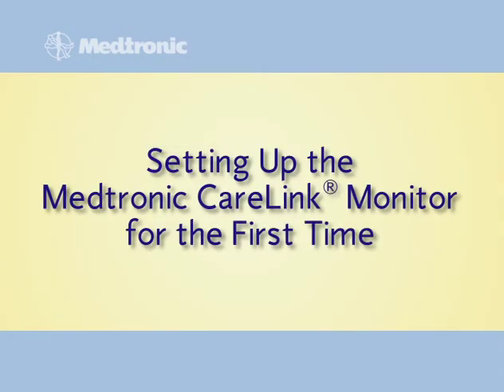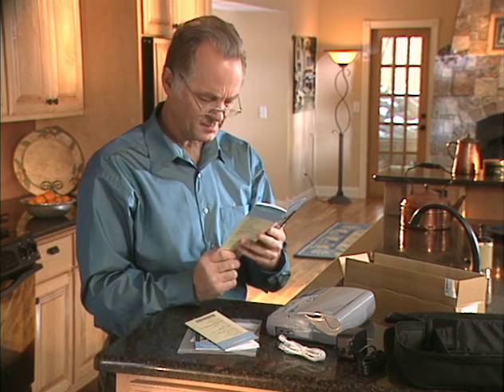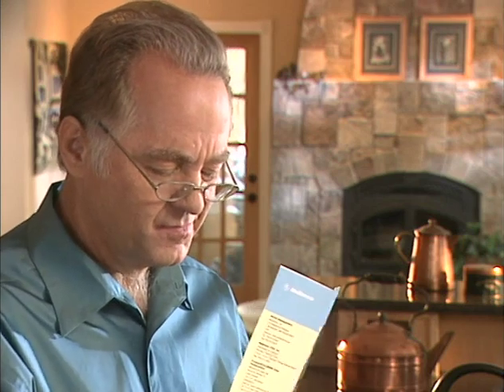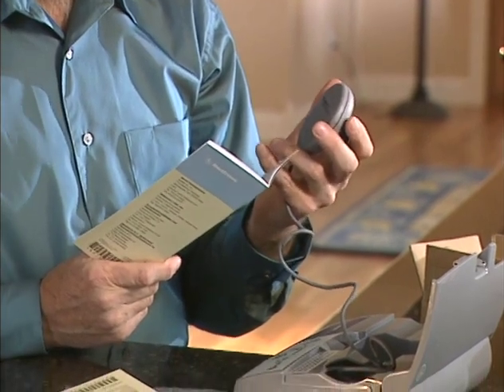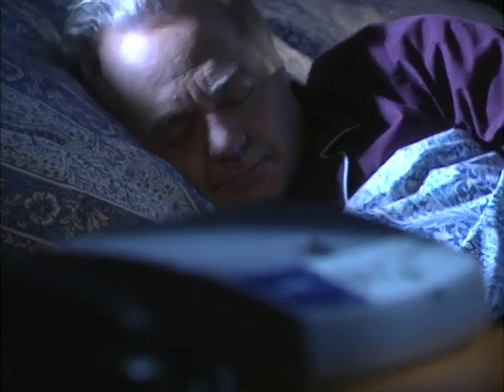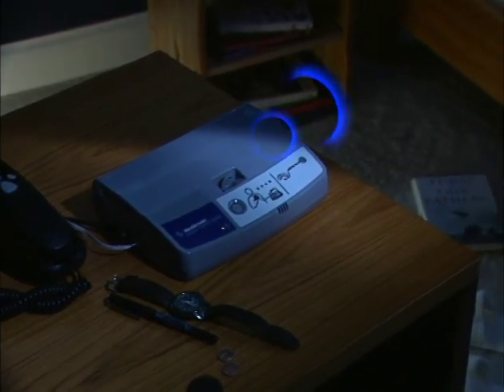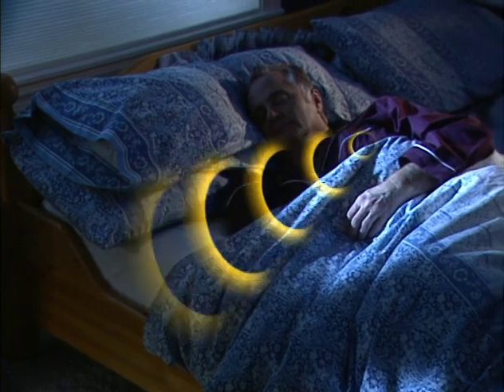Before you begin using the Medtronic CareLink monitor, it is important that you understand how to use it safely and how to properly set up and care for the equipment. Safety and equipment care information are contained in the patient manual. You should review this material carefully before you use the monitor. The first time you set up and use your monitor, you will be sending a transmission to your clinic using the hand-held antenna. After you perform this set-up session, the monitor will be able to communicate wirelessly with your specific heart device. The automatic wireless transmissions scheduled by your clinic can then occur without any action by you, usually while you sleep.